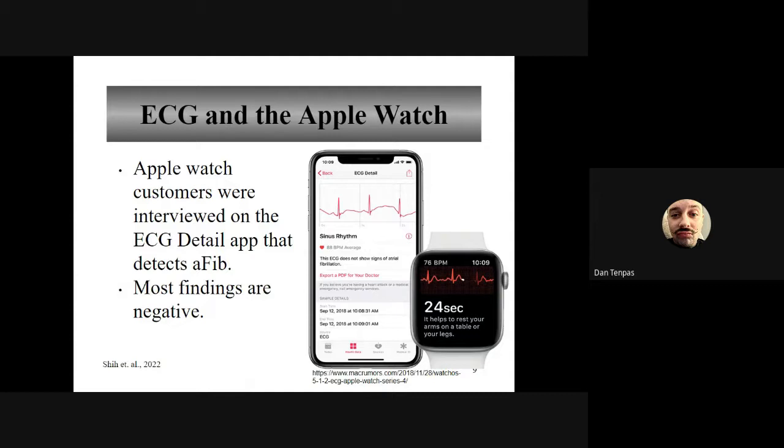And I quote from this journal article that I read, they said more medicine is not always better. So we do need to remember that there always are limitations and nothing ever is perfect. It might seem really fun to be able to watch your own ECG on your watch, but are we really getting good data is a good question to ask ourselves.